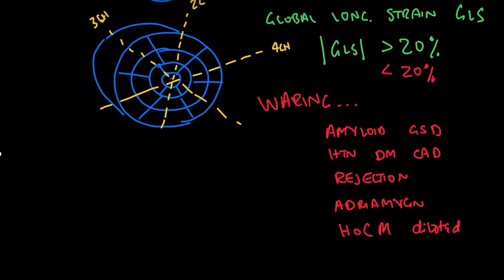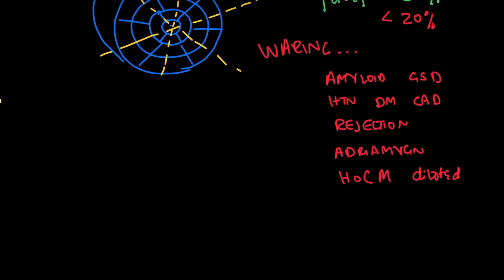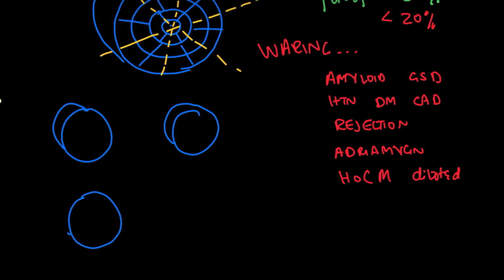And there's particular patterns. I'll just draw a couple of the patterns down here for your reference. So this will be looking at the left ventricle and then right ventricle off to the side, LV, RV, LV, RV.